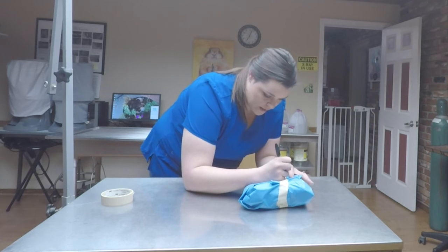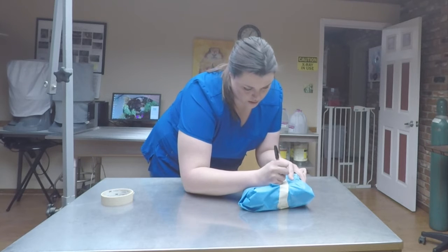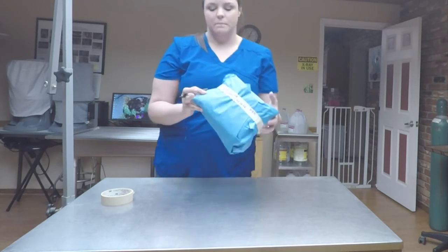I'm putting the size on there too. You put the date and the initials of who packed it. And that is how you wrap a surgical gown.